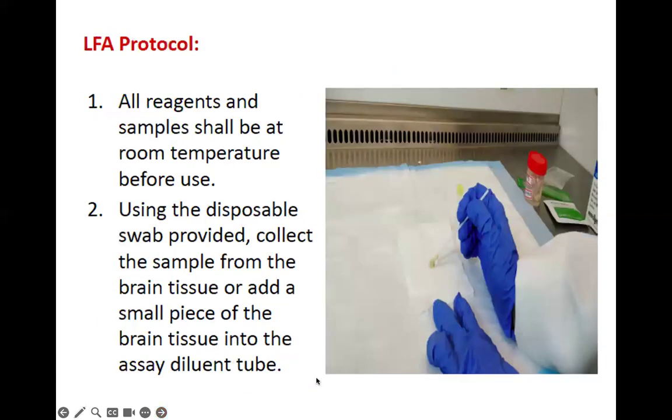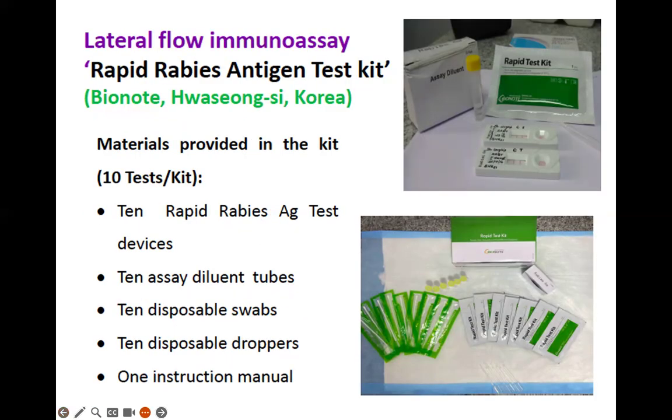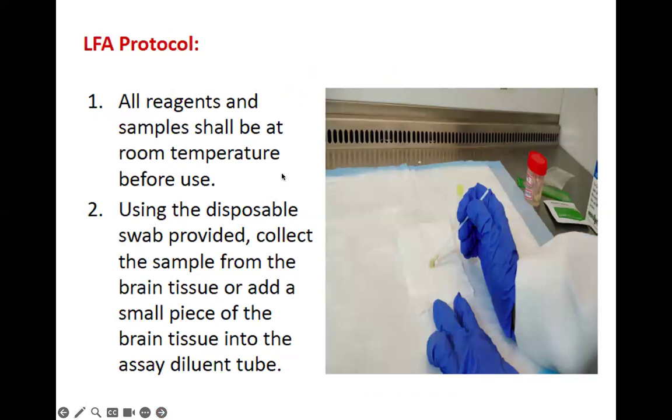So this is also based on our experience, and also based on the existing test kit that I have shown just now. Okay, the sampling of these samples is a bit tricky. So this also requires you to think about the best protocols for you to get the most antigen from the samples.